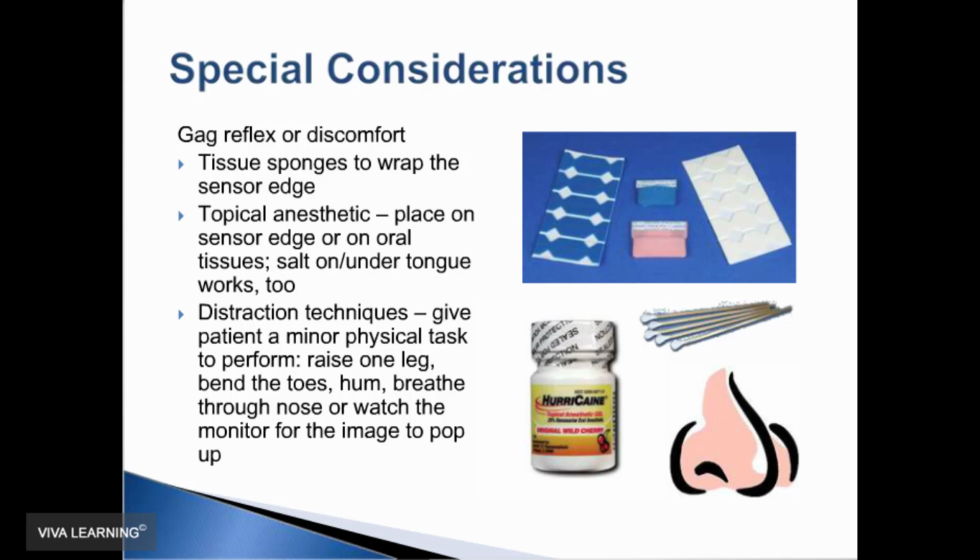We all have patients that have difficulty with radiographic techniques. And sometimes they do gag, and sometimes they do complain that the receptor is uncomfortable. I find that if I respond to their complaint by doing something, it always makes it better. And if I can gain their cooperation, I'm most likely going to be able to get a diagnostic view in that area where I'm taking the image.